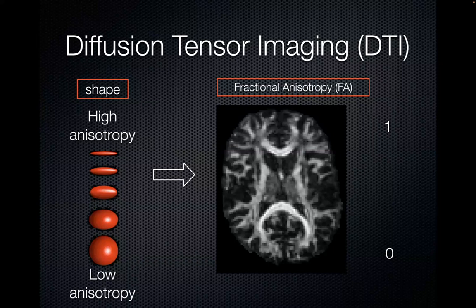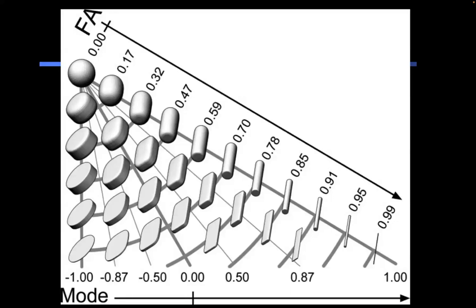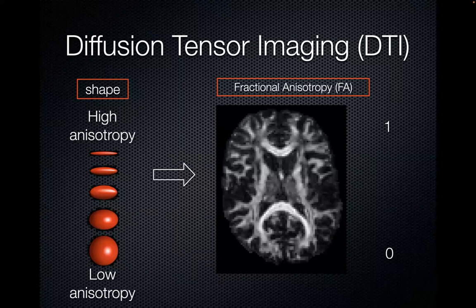And the question is for us as scientists, when we use FA, let's challenge the interpretation. Let's look beyond FA to interpret when things go down or when FA is in the range of these values here. Remember my talk and say, oh yeah, this could be different scenarios in the biology here. So let's be critical, and we have tools to actually zoom in and be a little bit more informed about what's going on with the tissue.